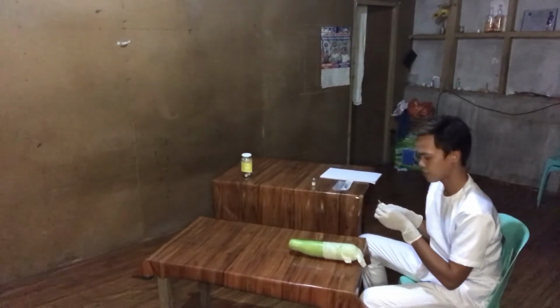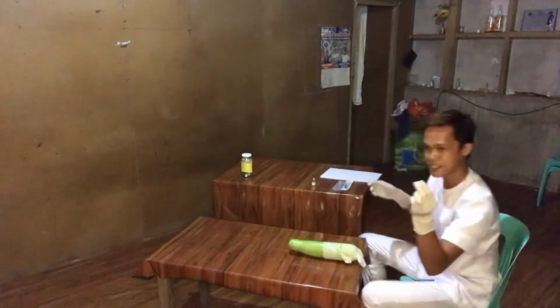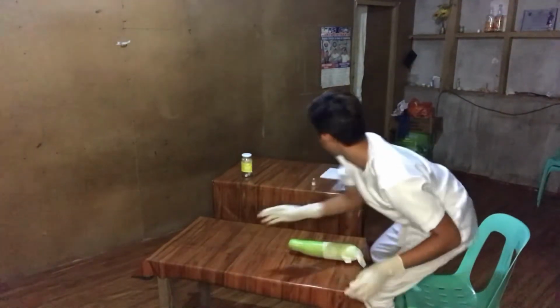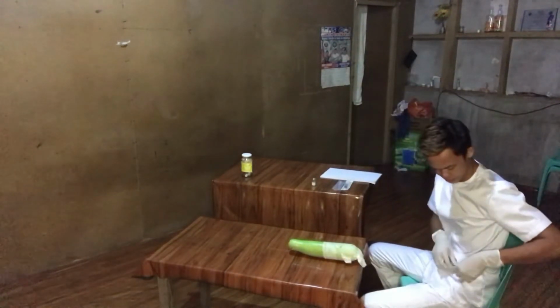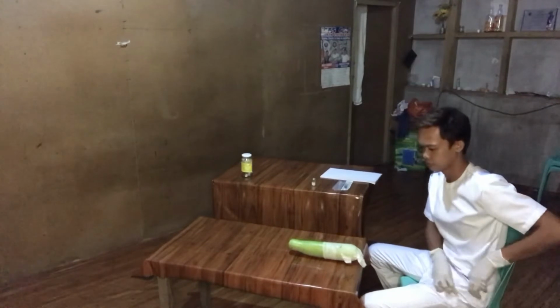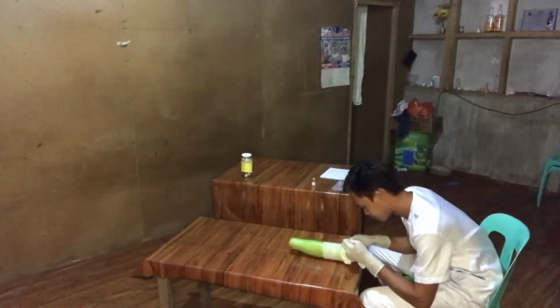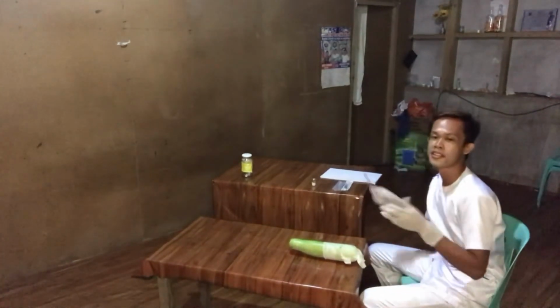Recap the injection. Return it to the medication tray and dispose of it in the waste disposal. For this time, we're going to encircle the site of injection. So now we're done with the intradermal injection.